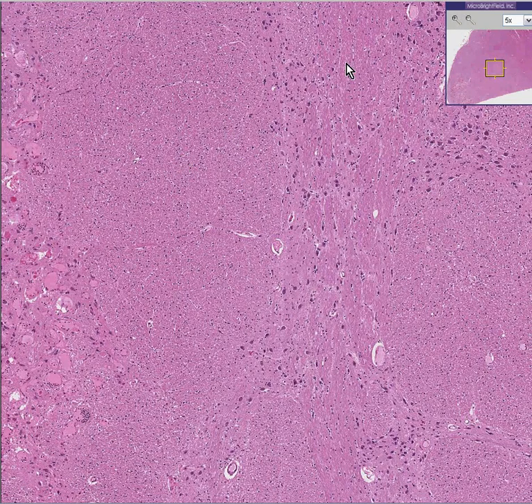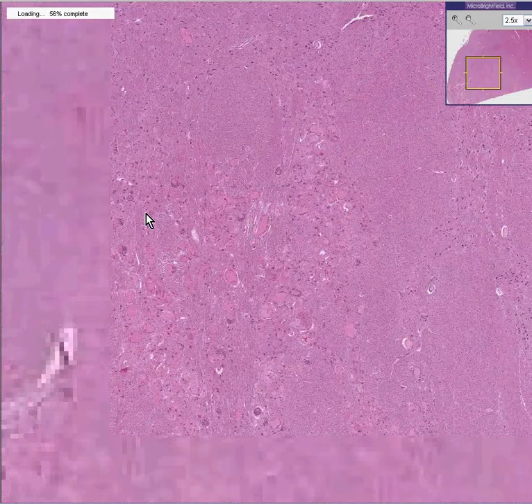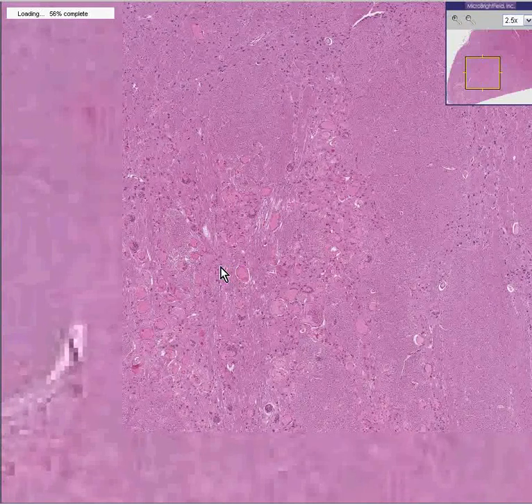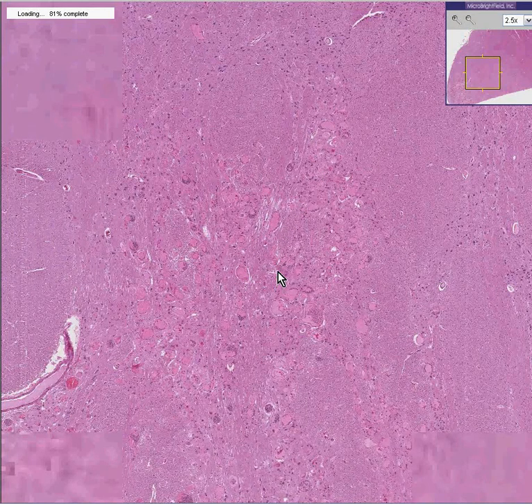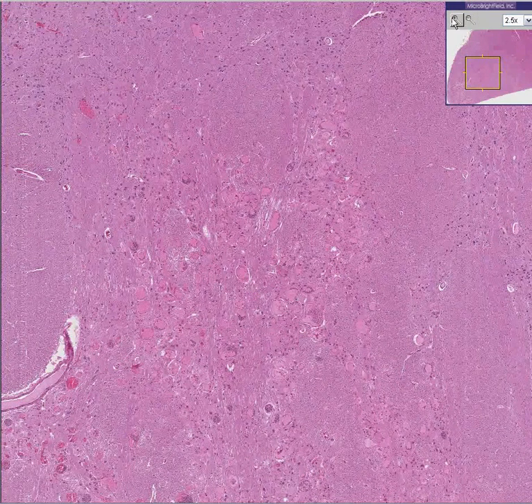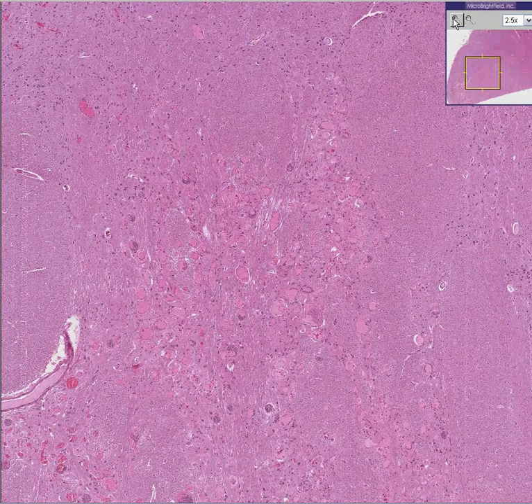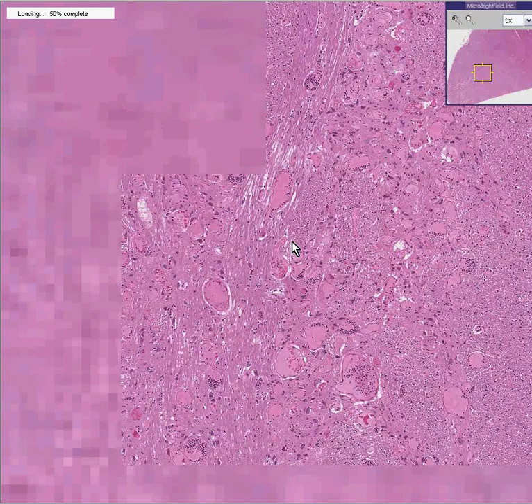The thing that probably distracts your appreciation for normal histology right away is that you have an area out here that doesn't look right at all. It doesn't look like anything we should normally see in the brain. It looks like maybe a bunch of blood vessels, funnily or weirdly arranged, in which many of them could very easily be thrombosed. This is an AVM.